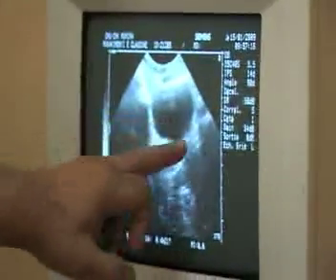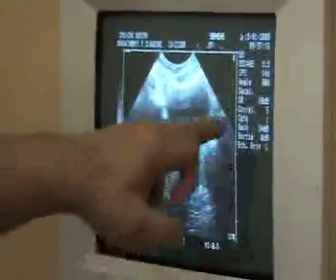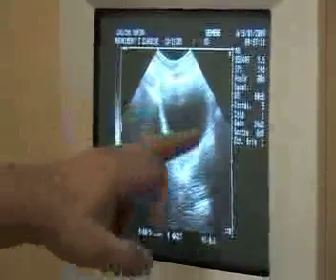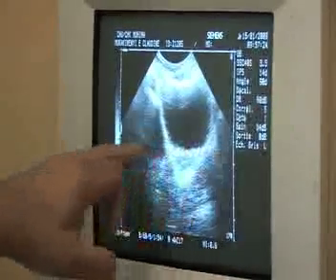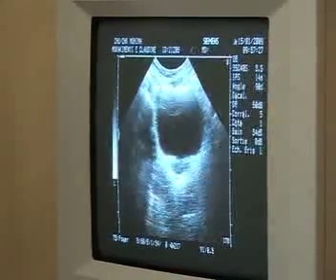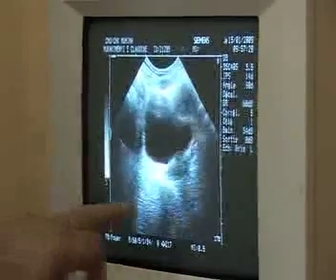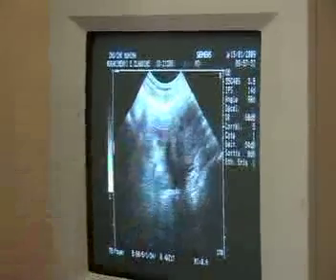Go back and don't move the transducer, just angle it. So that's her cervix there, that's her bladder. In transverse: that's anterior, posterior, patient's left, patient's right. So if you see something over here, that's your left ovary; if you see over here, that's your right ovary. Then we slowly angle up, we start to see the uterus, and we start to see that fibroid there.